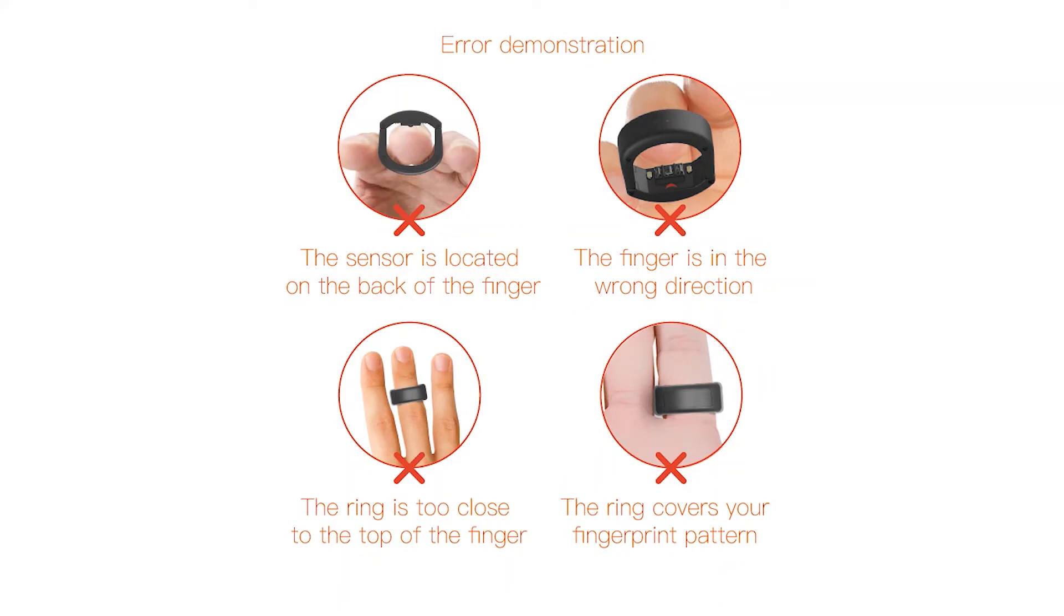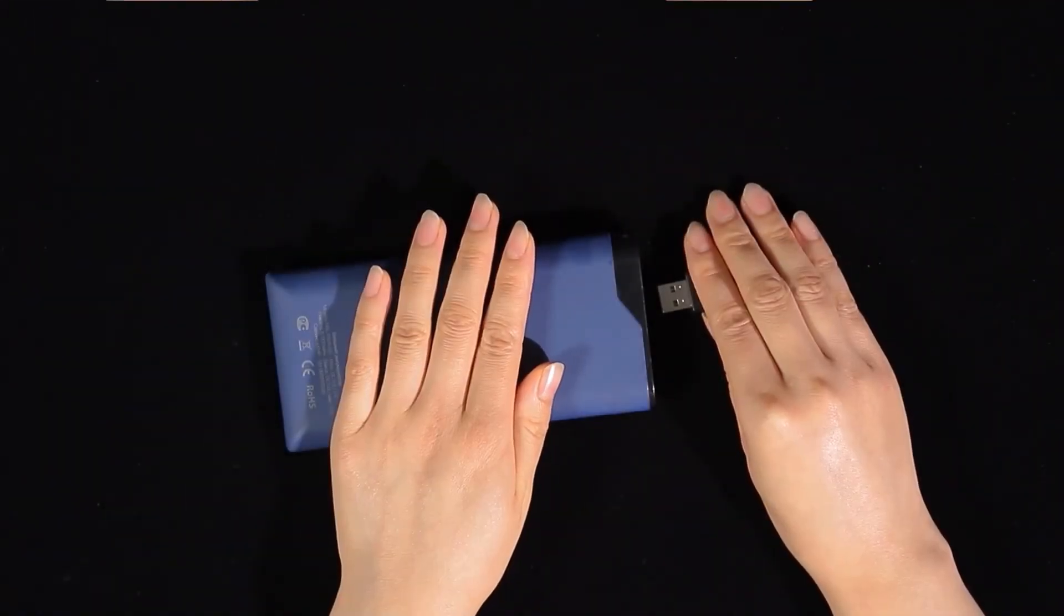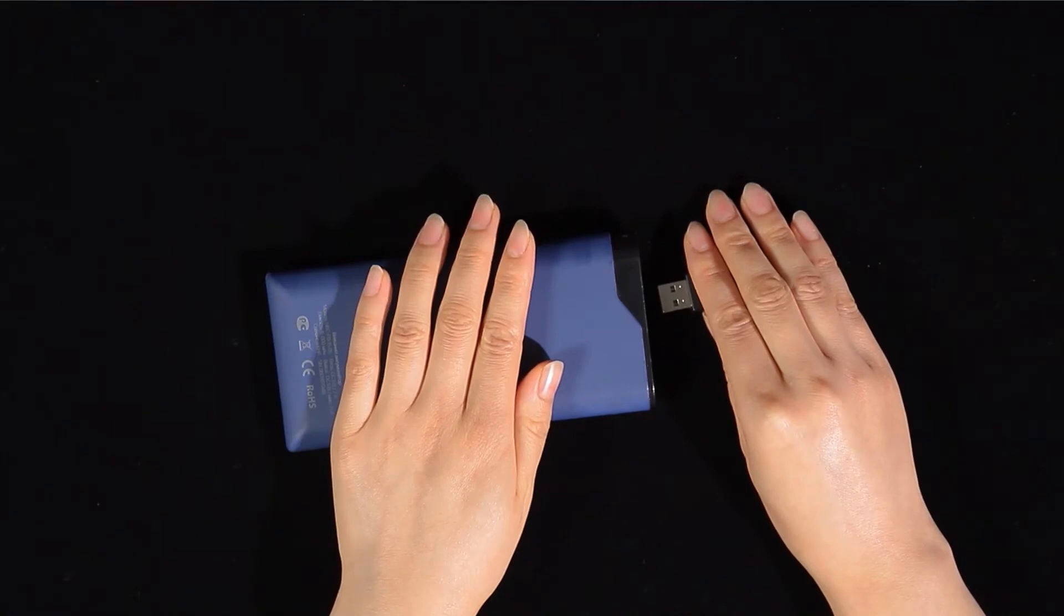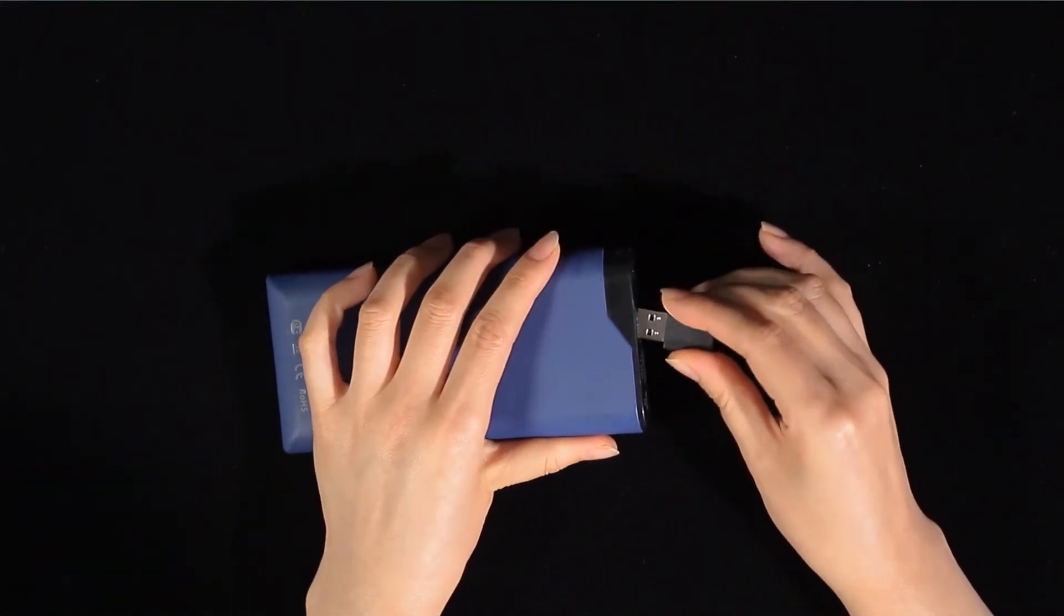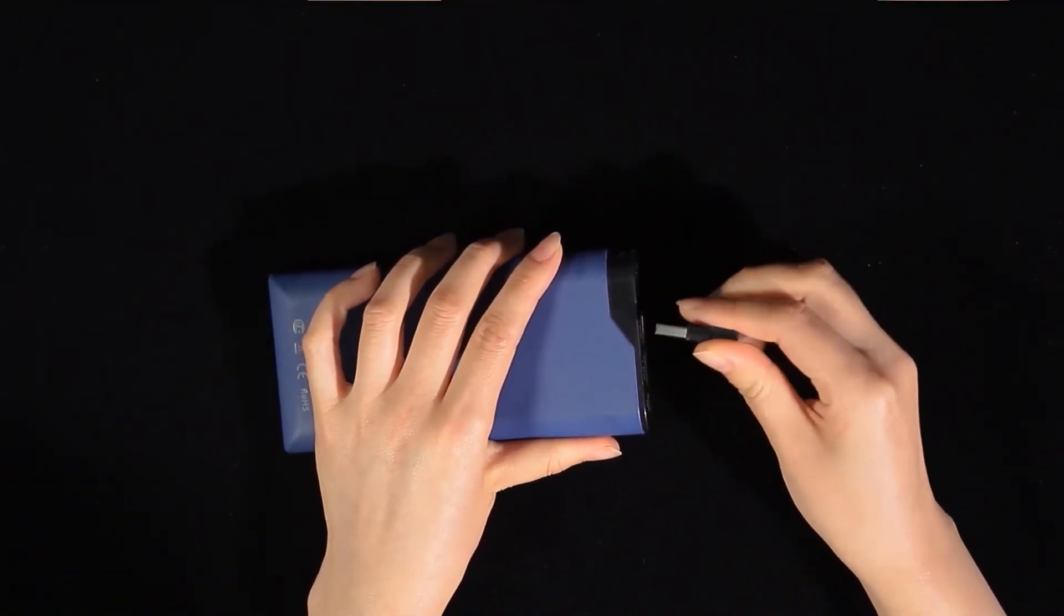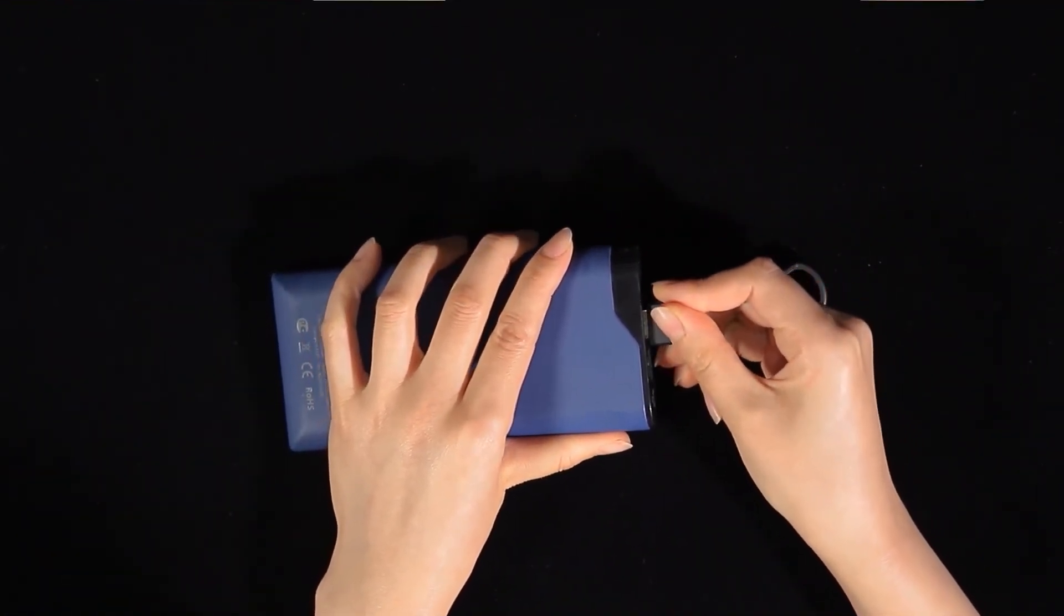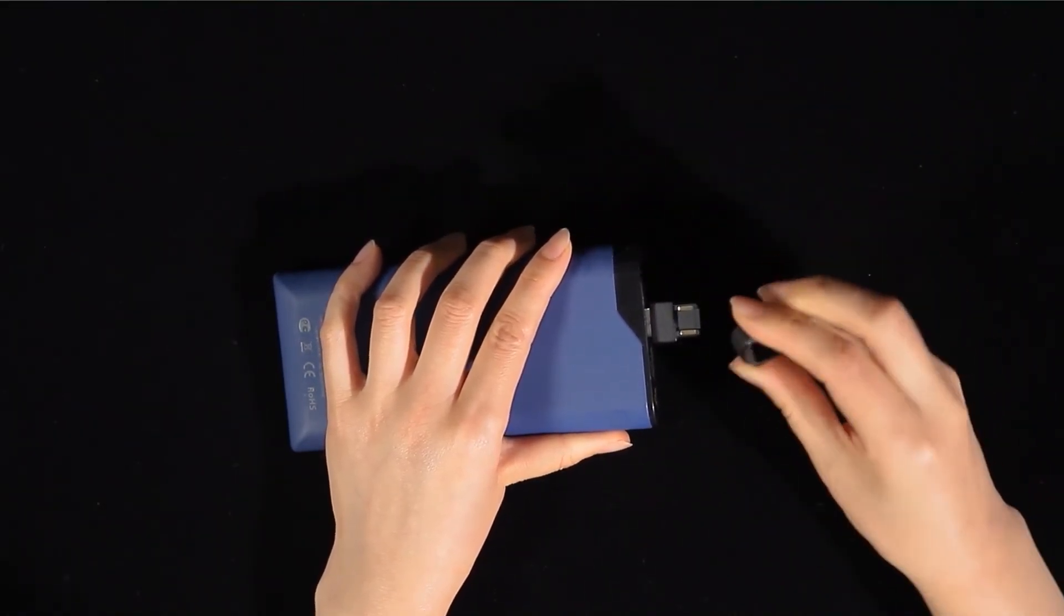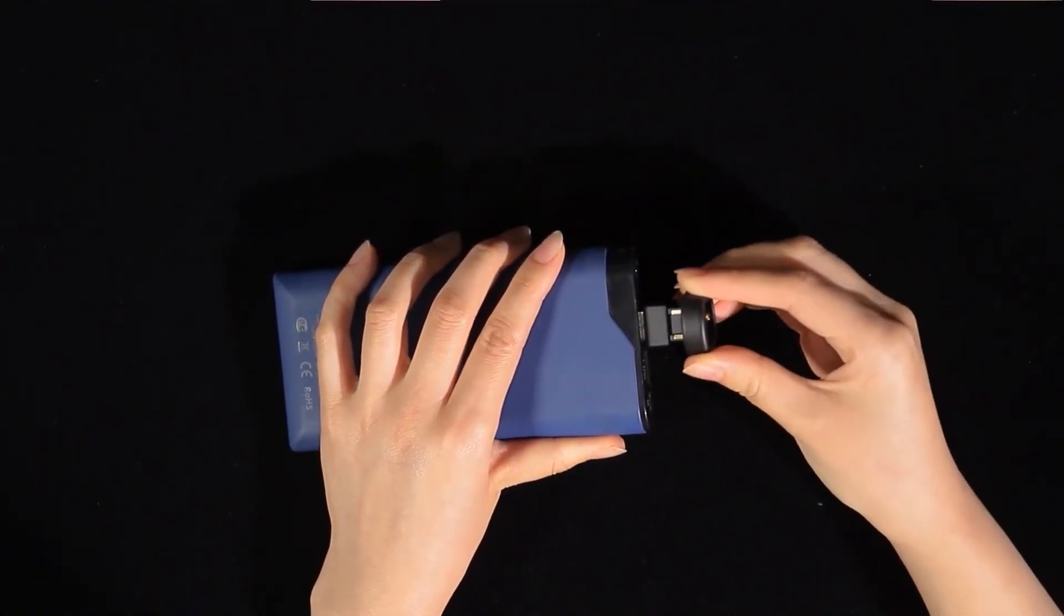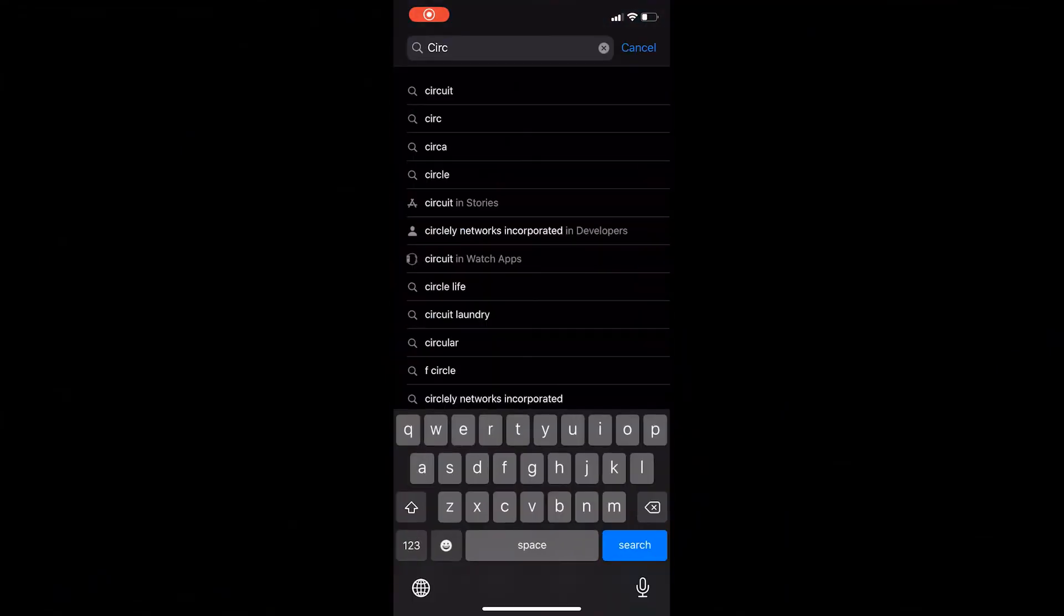Now we will show you how to properly charge the ring. Choose any USB port and plug in the charger. Put the ring on the charger with the magnetic contacts and a blinking green light indicates that the ring is charging normally.